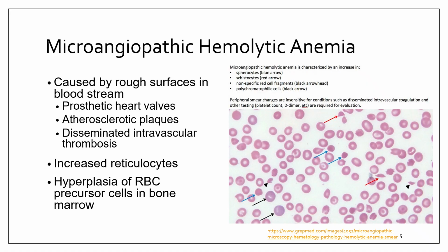This produces one of the most important smear findings in hematology, schistocytes, also called helmet cells, red blood cell fragments. These are diagnostic clues you should always recognize on a peripheral smear. On the smear, you may observe schistocytes, which are irregular, jagged fragments, spherocytes from membrane loss, and polychromasia from reticulocytosis. Also increased anisocytosis and poikilocytosis. The image on the slide shows multiple classic examples of fragmented red cells. If you see sharp angles, think trauma, not genetics.